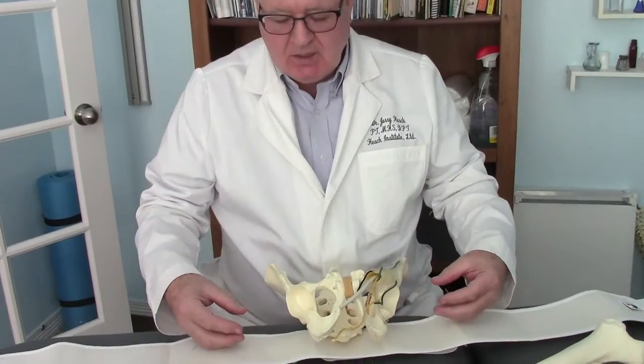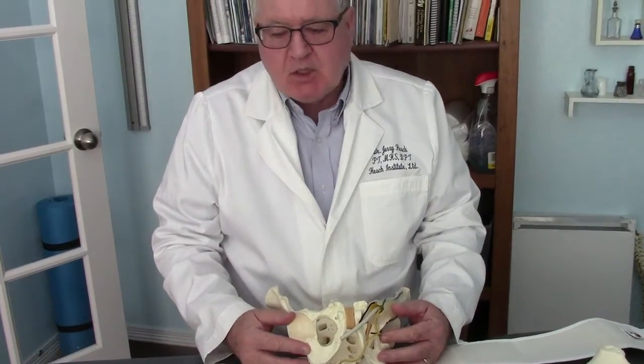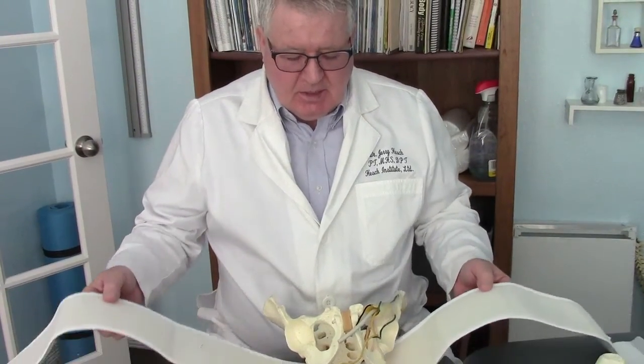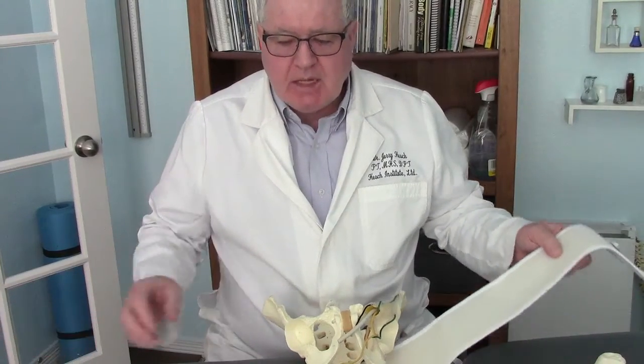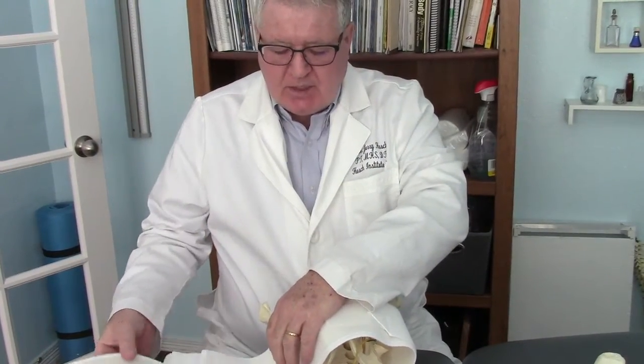This presentation is on pelvic supports for pubic joint dysfunction and for symphyseal diastasis. A brief summary of what we will cover is placement of a pelvic support worn at the level of the pubic joint, which is also the level of the trochanters, as being superior for pubic joint dysfunction, and it is a standard of care in the acute management of symphyseal diastasis, which is rupture with separation of the pubic joint.